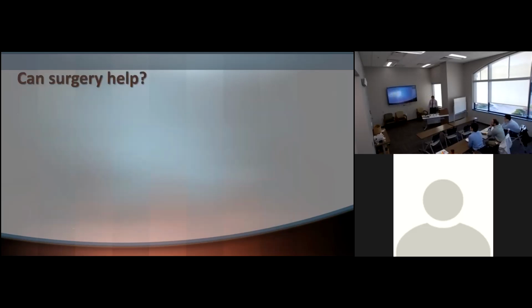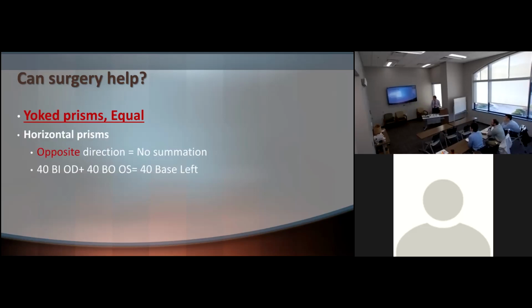So mom asked if surgery can help with this head posture. We can test that by applying yoke prisms. Yoke prisms are basically prisms held in the same orientation, but not in the same direction. Opposite direction, same orientation. So there is no summation here.